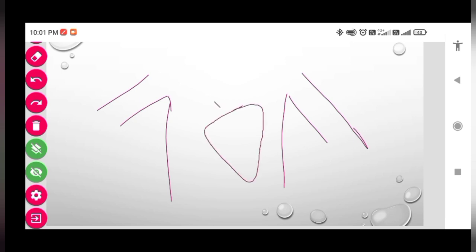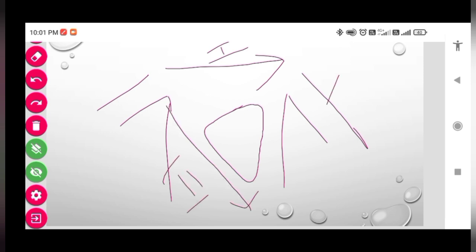So this is the base, this is the apex of the heart. Okay. So if you see, this is lead 1, this is lead 2, and this is lead 3. If you observe carefully, lead 2 is along the cardiac axis from base to the apex.